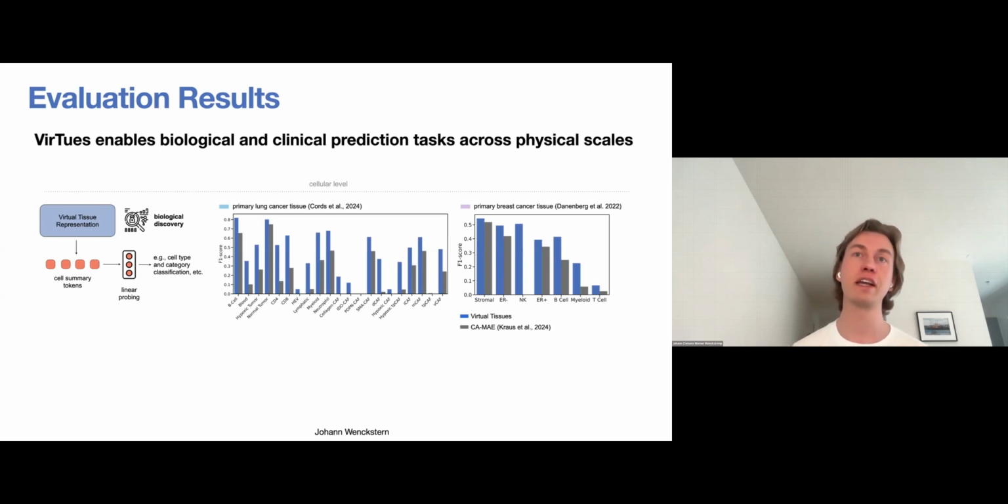And so we had lots of very fine-grained cell type labels for fibroblasts, some very rare. And there was a general trend that the model prediction performance got better on more frequent cell types, such as just tumor cells, and decreased with rare cell types, such as rare CAFs, which improving upon is current and future work.